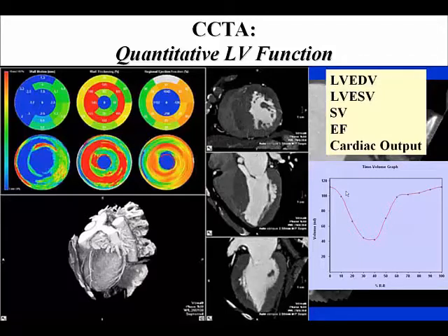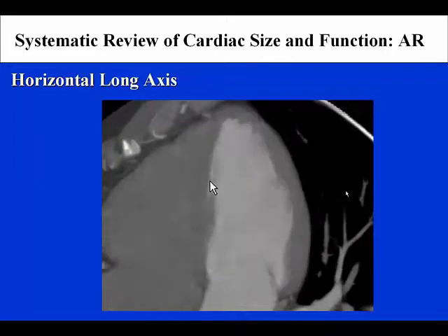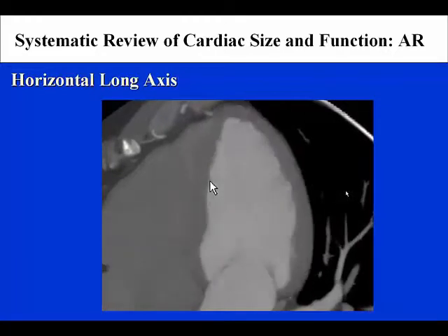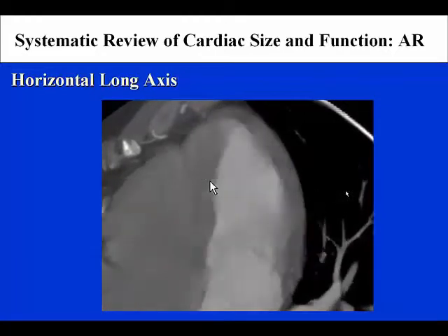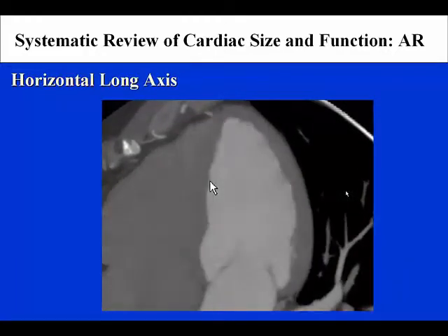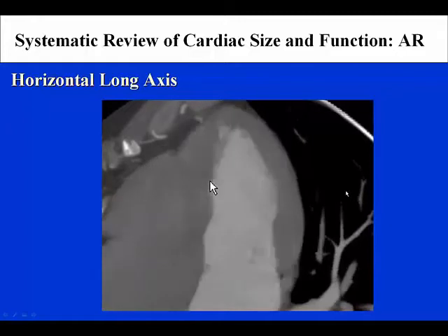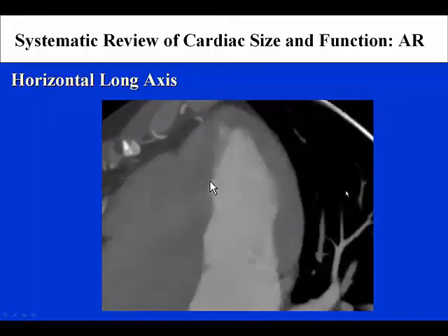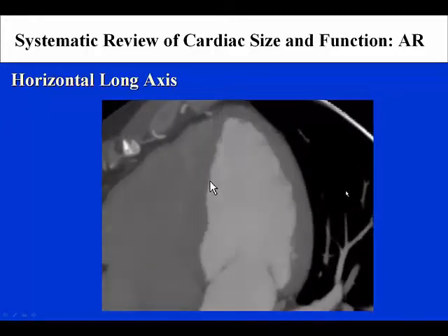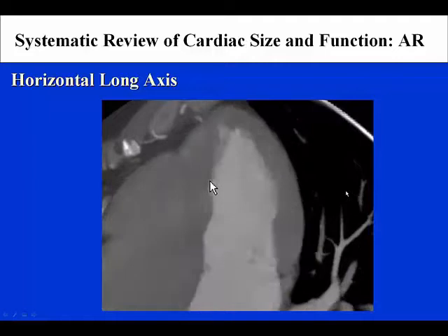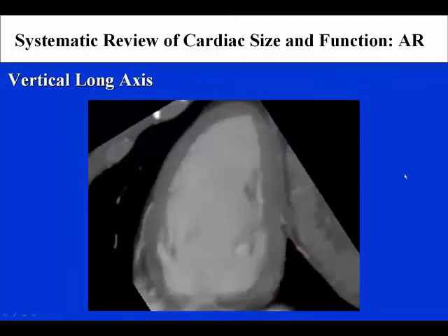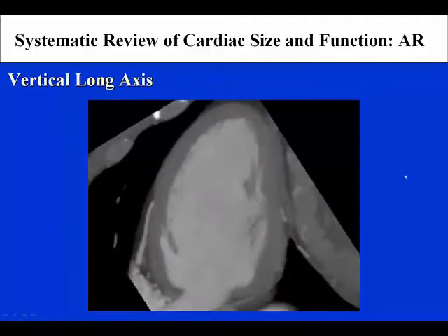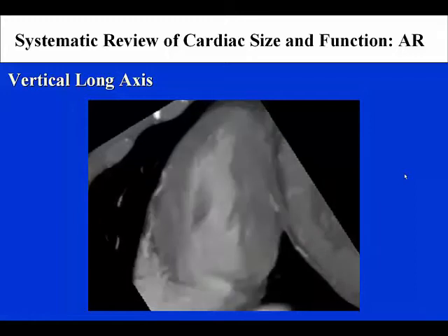Shown here in our example patient AR is the horizontal long-axis view, demonstrating the septum, apex, and lateral wall motion, which appears to be normal. Next is shown the presentation in the vertical long-axis, demonstrating the anterior wall, apical wall, and inferior wall, which again demonstrates normal cardiac motion.